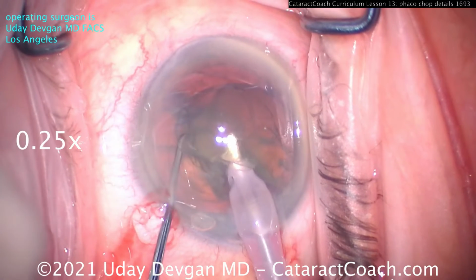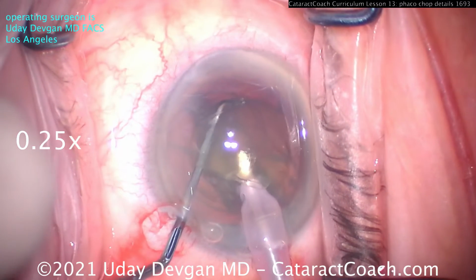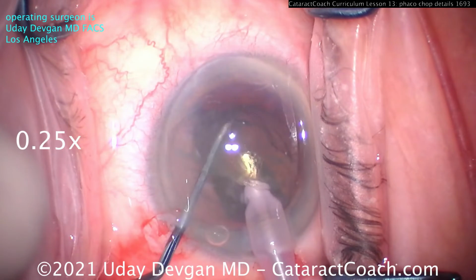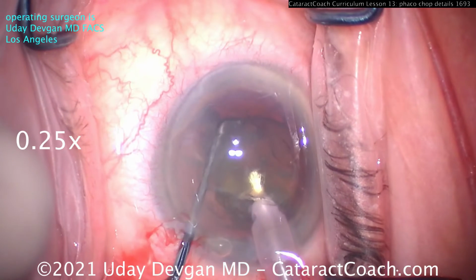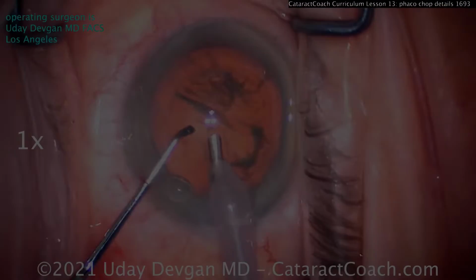And there it is. And once it's partially up in the anterior chamber, chopper can go around it, and we can sub-chop it again. So that's the key move. Watch this video a few times if you need to. And then let me show you one more time in real time.